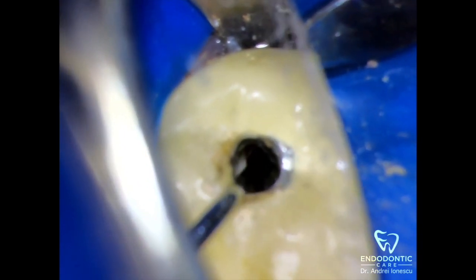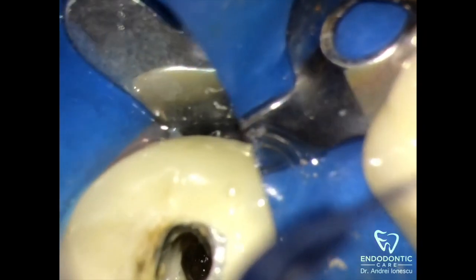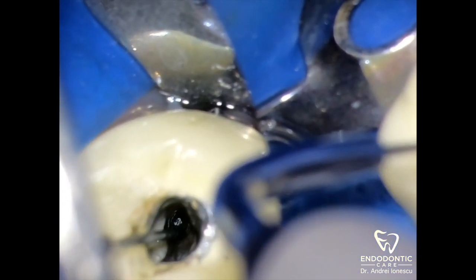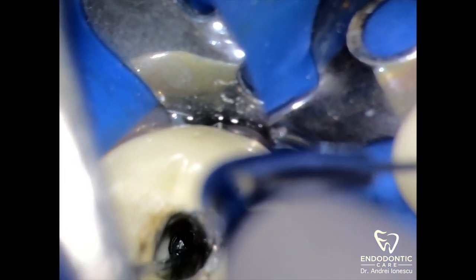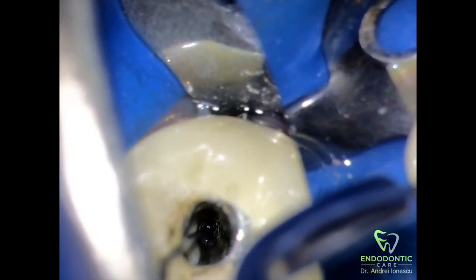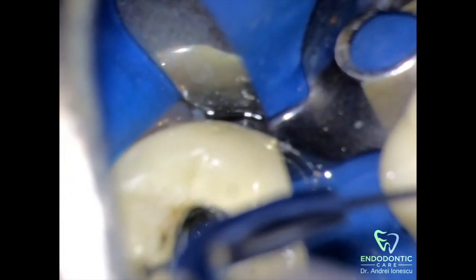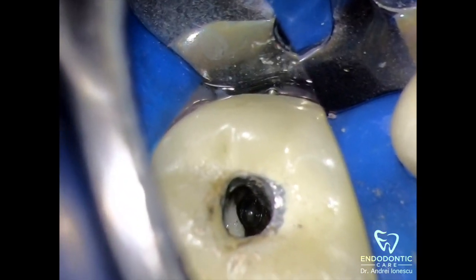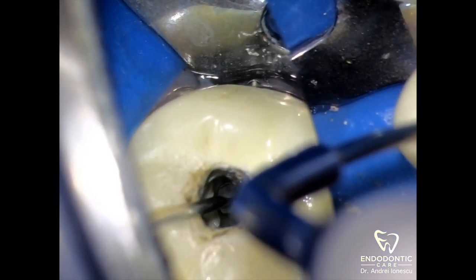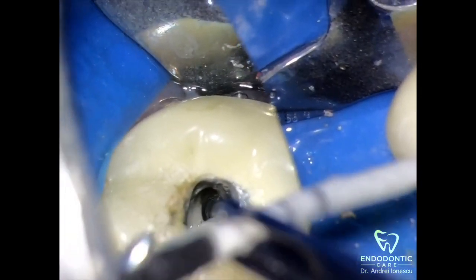Next you can use a thin long ultrasonic tip to try to loosen the file a little bit. Here I'm using an ET25 ultrasonic tip at a medium to low setting, simultaneously trying to loosen the file and remove a little bit of tooth structure on the inside aspect of the curvature. A word of caution: increasing the power on the ultrasonic will cause the file to break again, leaving a smaller portion in the tooth and making removal much more difficult. So avoid temptation, keep the setting very low, and rinse with your irrigation solution frequently to avoid causing the tooth structure to overheat.